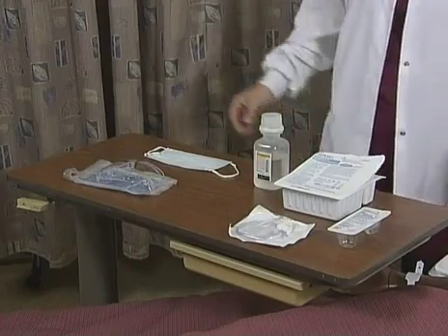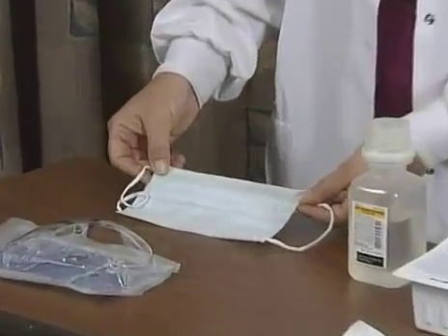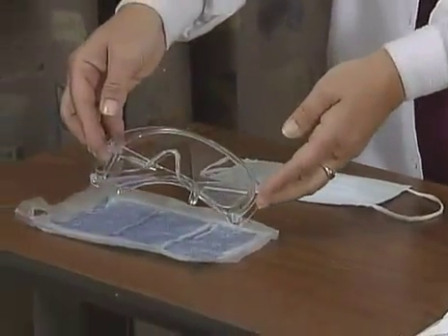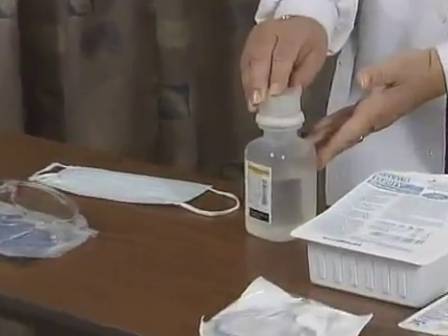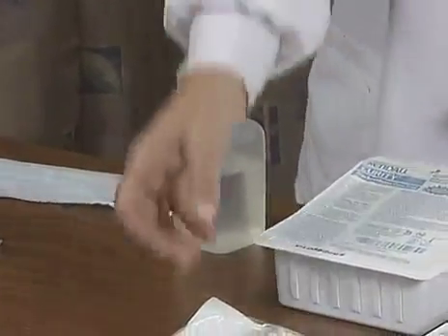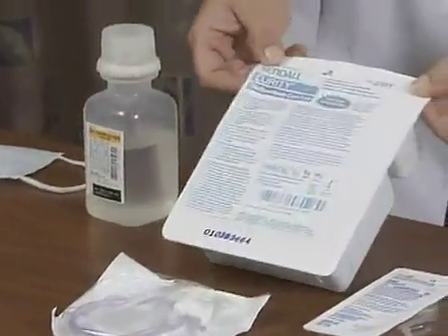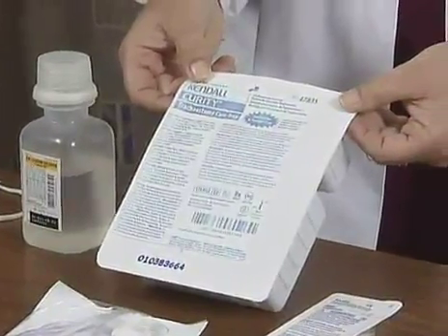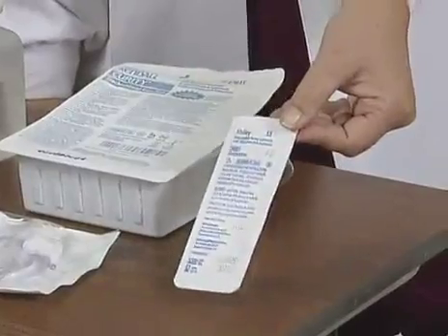It's important to gather your equipment prior to tracheostomy care and suctioning of your patient. The first equipment that you gather is your personal protective equipment such as a mask, goggles, normal saline, a suction catheter, a tracheostomy care tray, as well as a disposable inner cannula.